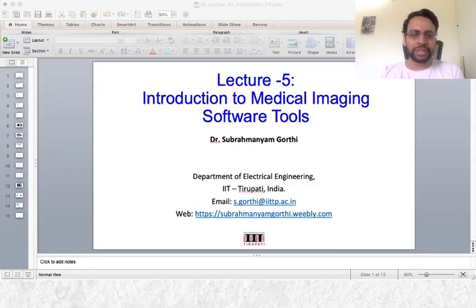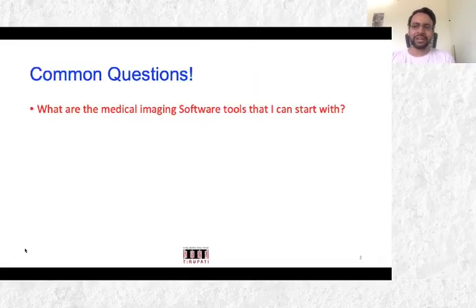In this video lecture, let's try to answer a few more questions that are commonly posed by students. What are the medical imaging software tools that I can start with when I start studying this medical imaging course? In this, again, there are different types of questions.